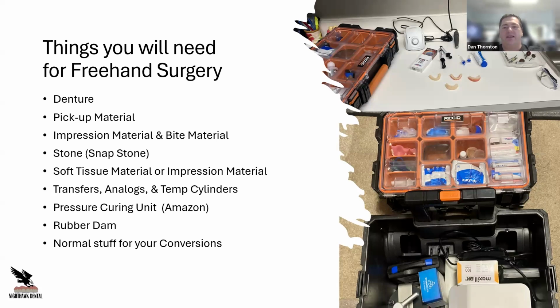Now, it's always nice, myself, I like to, after I get done with my conversions, clean up after myself a little bit. So I kind of leave it the way I found it. A lot of times they appreciate that a lot. And then I help them if I need to with marking on what abutment was where, what implant was what placement. So technically I kind of turn into part of their staff, helping them with the record keeping. Especially if I'm the one that's going into the surgery that's providing all the parts and everything else, that way I have a list as a reference for later on. Because then later on, you want to be checking all the temps. You're going to be doing everything else again later, making sure everything is at torque value before we start picking up for the final prosthesis.